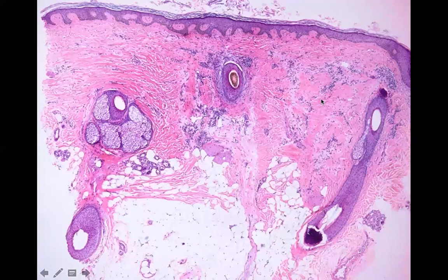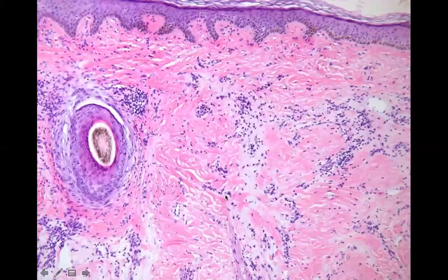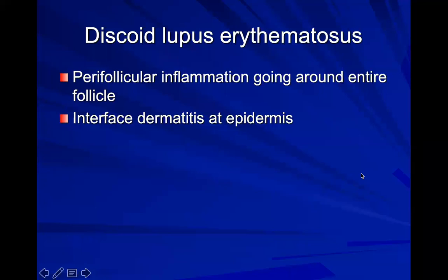Although sometimes it's hard to tell if you're just in an area where, if you cut one section deeper, you're going to see the edge of a follicle coming in, which is why it can be challenging. But it's nicely illustrated in a vertical section where your inflammation is. Okay, so here's your perifollicular fibrosis, your lichenoid inflammation that got pushed out a little bit, and here's your missing follicle with a little bit of fibrosis right in the follicular area.